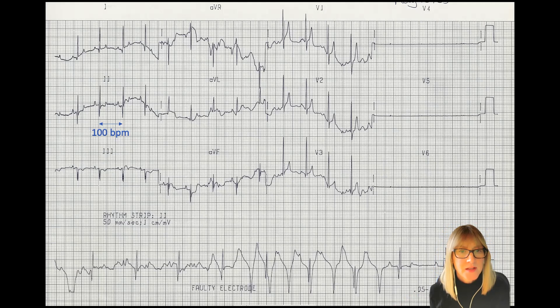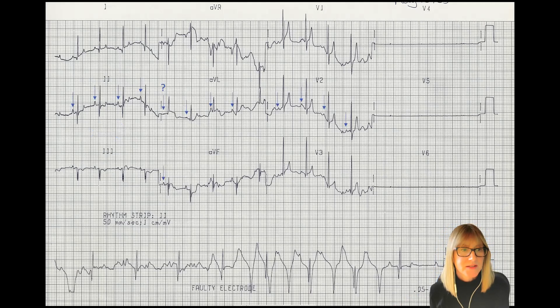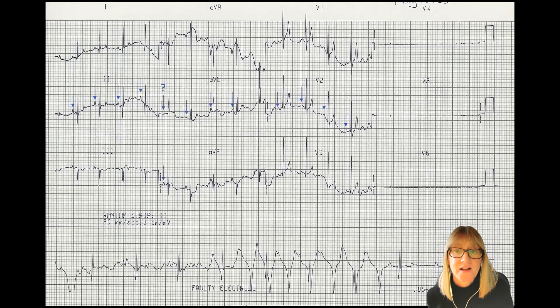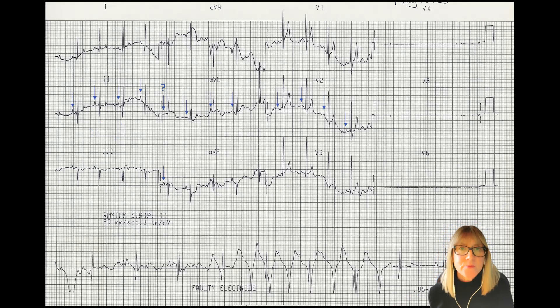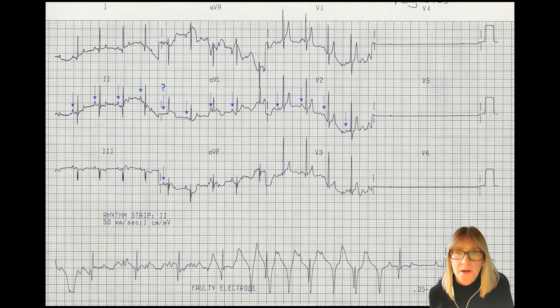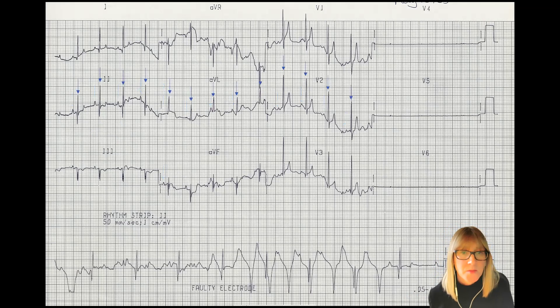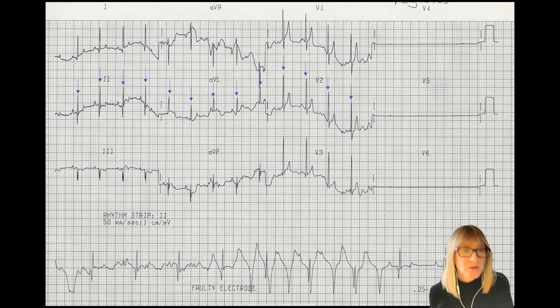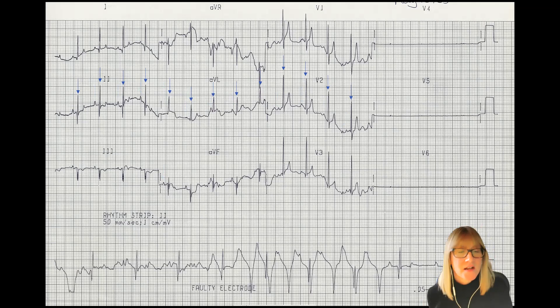My rhythm looks pretty regular. Are there P's for every QRS? I have arrows above what I identify as my P waves all the way across. Even when I have a question about a P wave — as shown above the fifth arrow from the left — when I look in a simultaneous lead, I can certainly find an identifiable P wave. I can easily identify all my QRS complexes across the strip, and within a lead, the P waves and QRSs look reasonably the same.